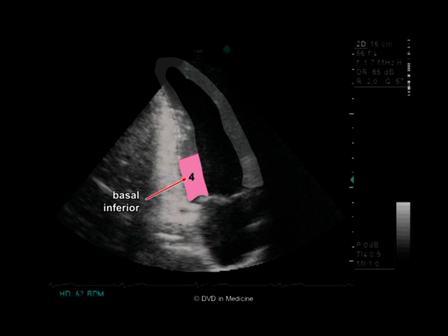Basal inferior, mid-inferior, apical inferior, apical anterior, mid-anterior, basal anterior.